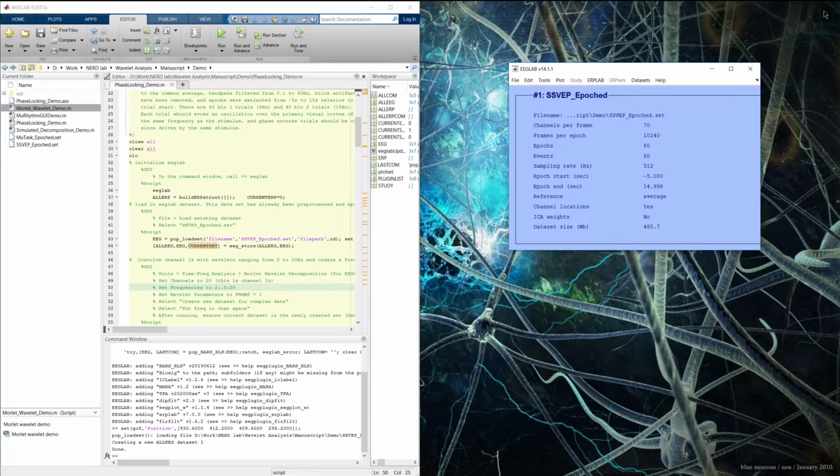Quickly though, I'm going to give an overview of how we're actually going to calculate this, since it will require a few different steps. Of course, intertrial phase locking is a measure of how similar the phase at a particular frequency is across multiple trials at a given time point. If you're not already familiar with this though, there are much better sources for understanding it than this. I doubt that I'm going to explain it here in a way that will make much sense to anyone that isn't already familiar with the measurement. This is really just to serve as a reminder.